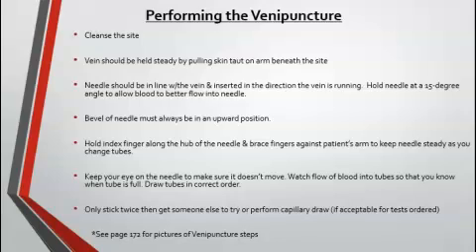You want to watch the flow of the blood into the tube so you'll know when the tube is full. And you want to make sure that you're collecting the tubes in the correct order of draw. Only stick a patient twice, and if you can't complete a successful draw within 2 sticks, then ask someone else to complete the blood draw, or you could do a capillary stick.